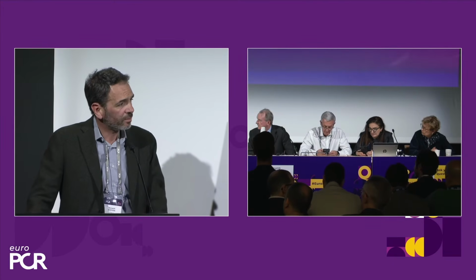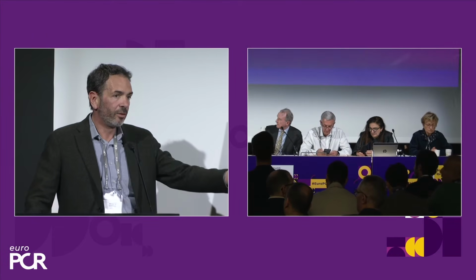So far in Transform 2, how many patients were not enrolled because of some dissection and went over to stenting from the very beginning? Do you have the number? In Transform 2, yeah, there is a nested registry. We are including that. We have so far 330 patients who did not enter the study. Now we have enrolled 900 patients. So 300 out of 900, so it's 25%.